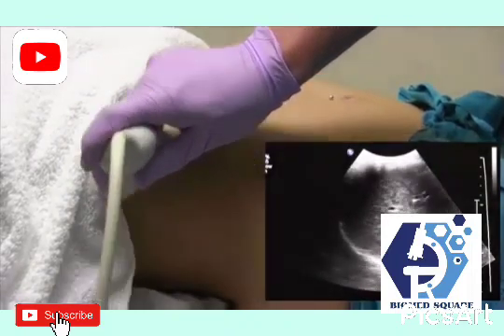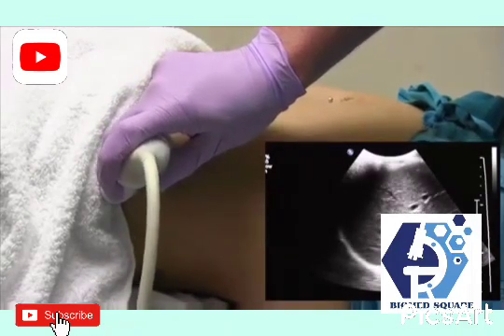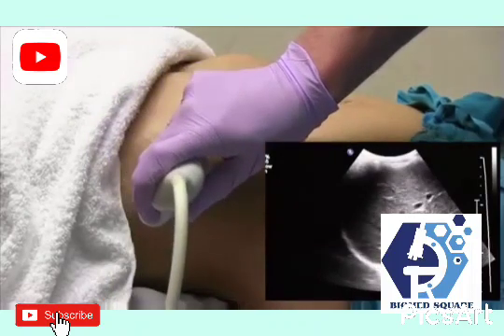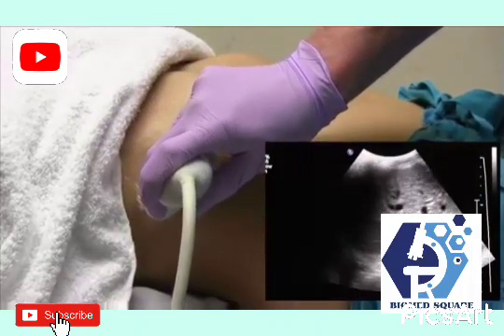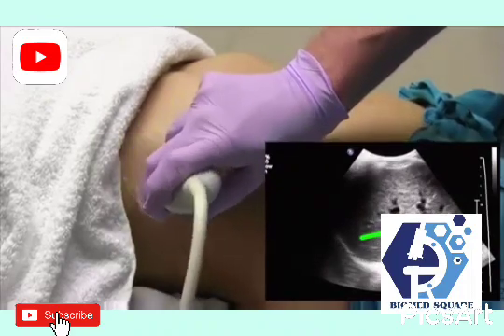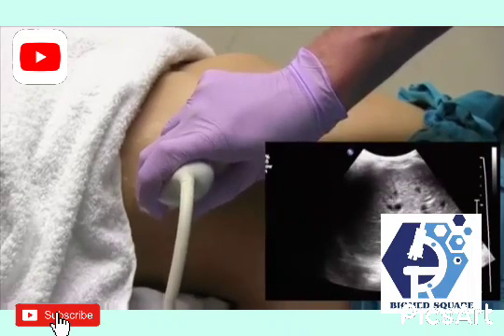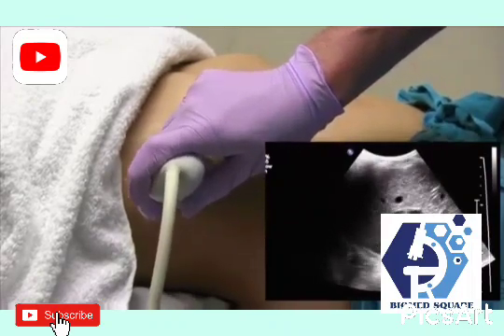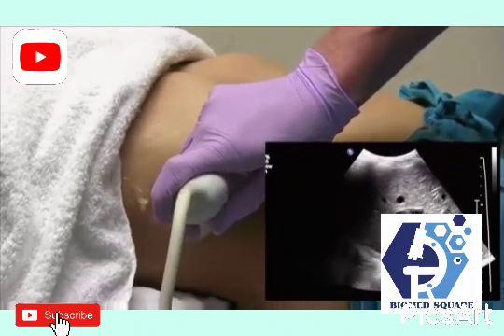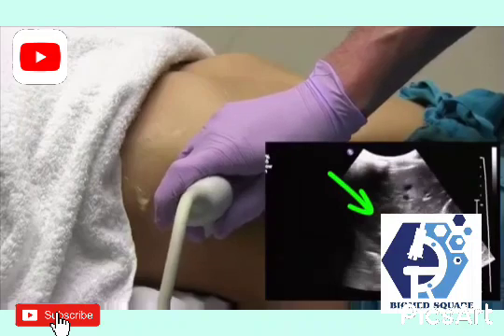As you're doing this, you're still getting those same pictures, one at the dome of the right lobe, one at the hepatic veins, and then as you jump down, you'll get a picture of the main portal vein, and you can also see the main portal from this window split into right anterior and right posterior portal vein. At the last rib space, you should start to see the upper pole of the kidney against the liver surface.